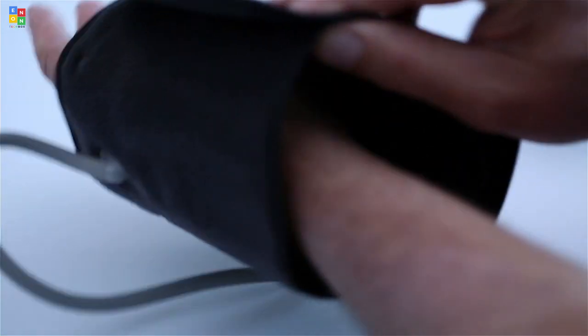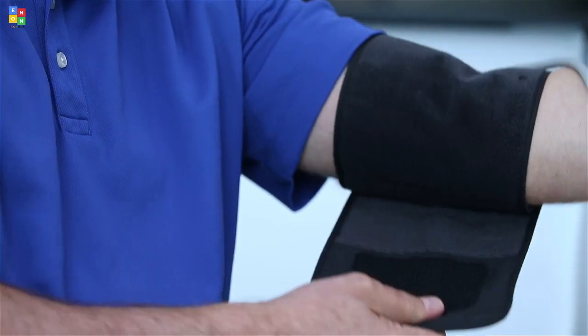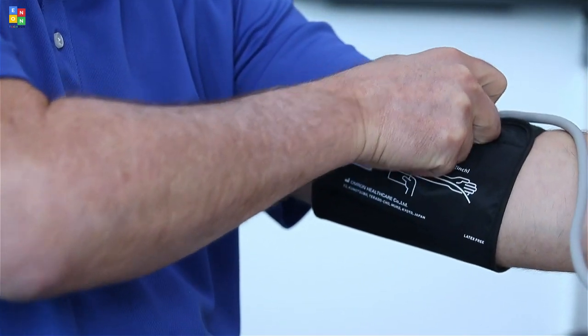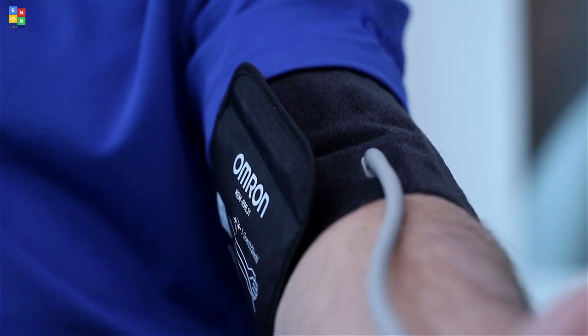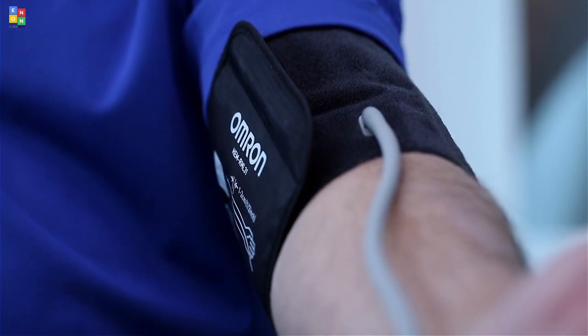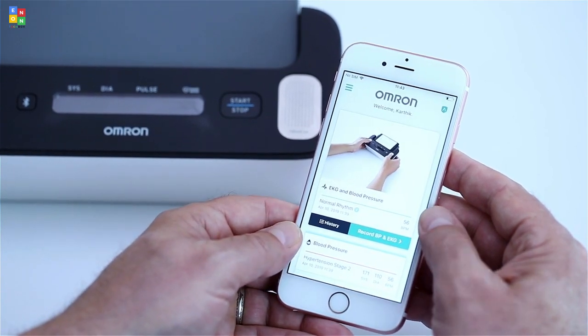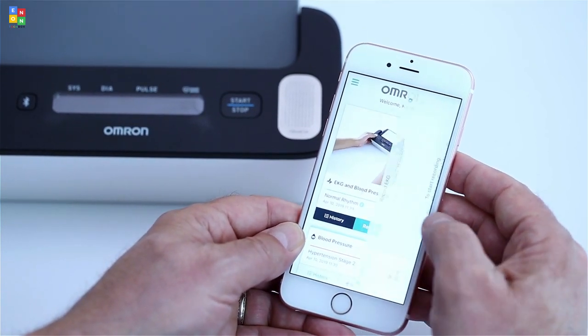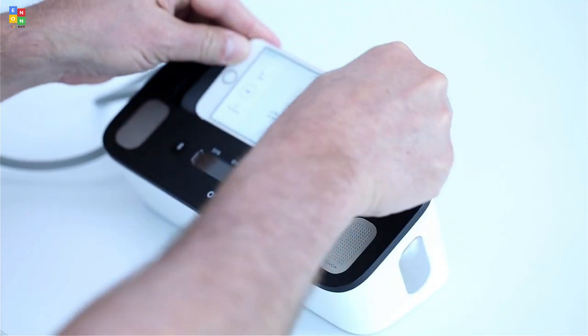Step 4. Wrap the arm cuff firmly in place around your left upper arm and secure with a fabric fastener. The arm cuff should be placed on your arm at the same level as your heart. Ensure the air tube is on the inside of your arm. Step 5. Open the app on your smartphone and select Record BP and EKG. Turn the phone into landscape orientation and place it on the smartphone cradle.